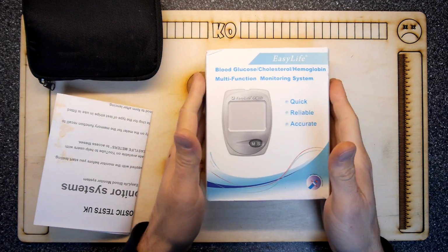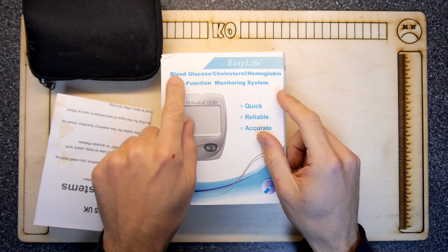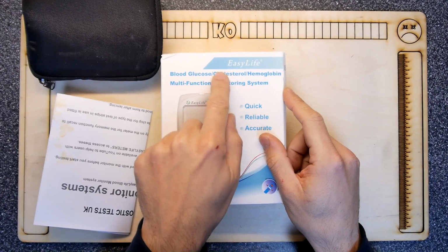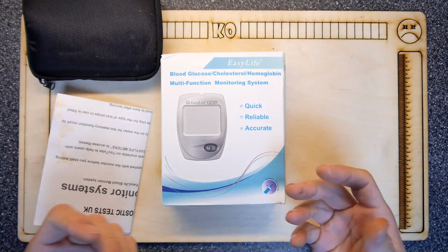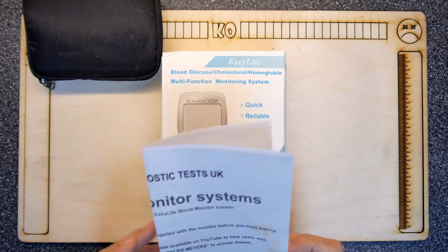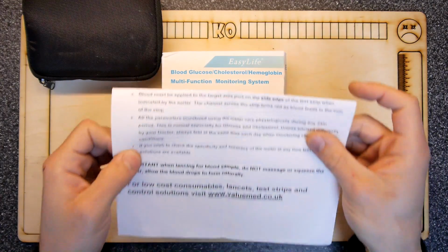So I've gone for this Easylife blood glucose, cholesterol and hemoglobin testing machine. That's going to do basically your blood sugars for your diabetes type stuff, your cholesterol for your general cholesterol-y type stuff, and your hemoglobin, which is interesting because it's for your iron, to see if you're anemic. So I just thought if you're doing exercise, that could be a useful option. You have a third option. The other one I think was uric acid, and I had no idea what uric acid tested.